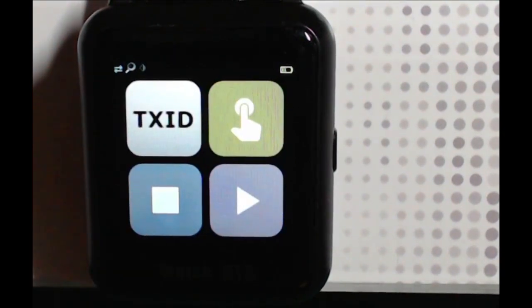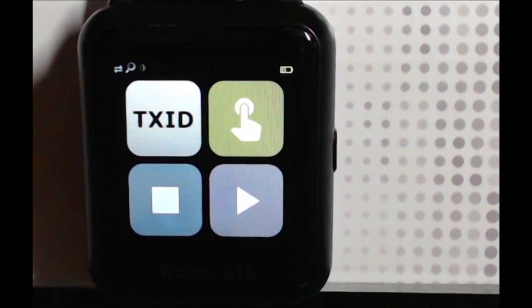On this page, there are four options: setting the transmitter ID, calibrating, stopping a sensor session, and starting a sensor session. Select the top left TX-ID button.